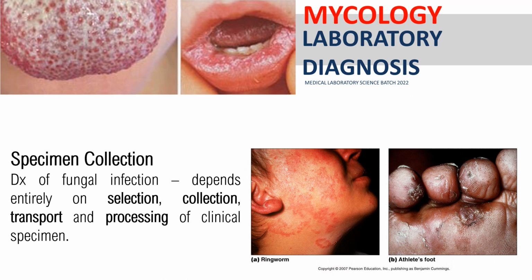Ayan. So, for example, you have ringworm and athlete foot. So, these are clinical manifestation caused by your superficial mycosis. So, pag dito pa class, anong kailangan na sample na i-collect mo? Magko-collect ka ba ng blood? Tama, class, hindi. Bakit? Kasi ang clinical manifestation niya ay skin infection. So, ano yung appropriate collection mo? Tama, class. Either magsaswab ka or magsiscrape. But in this case, class, better na magsiscrape ka or skin scraping.